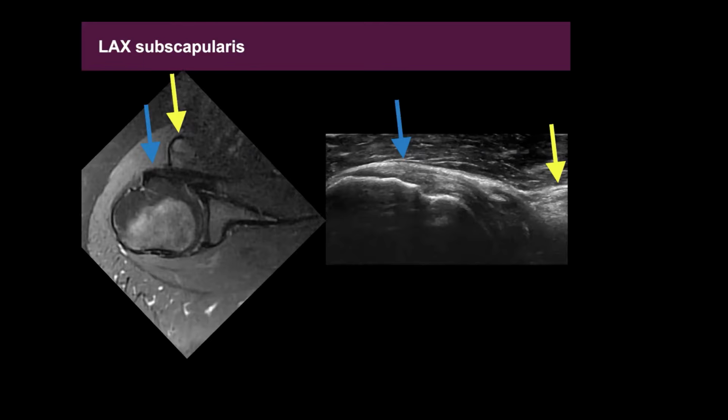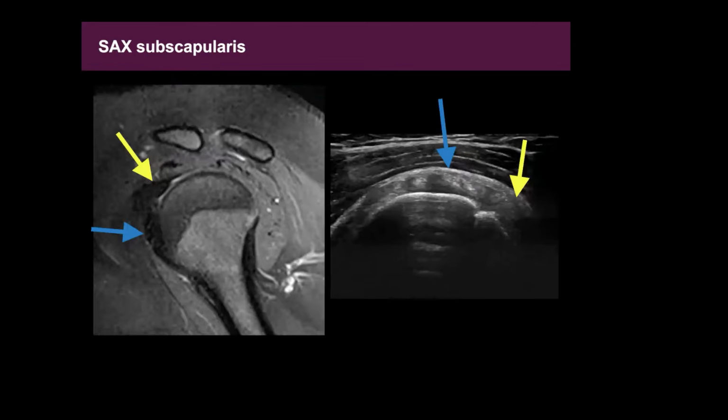And again, just like the normal supraspinatus tendon, you can see how a normal subscapularis tendon has a very similar appearance. It has that thin, hyperechoic, fibrillar, again, like angel hair pasta appearance. So that's, again, a normal appearing tendon, and normal appearing ligaments also appear very similar.